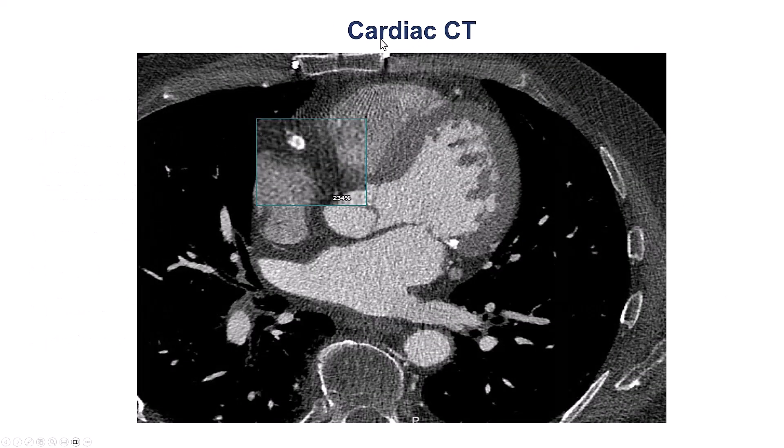This is a coronary CTA, which we often do, especially for cases with previous failure, showing significant calcification of the right coronary artery.